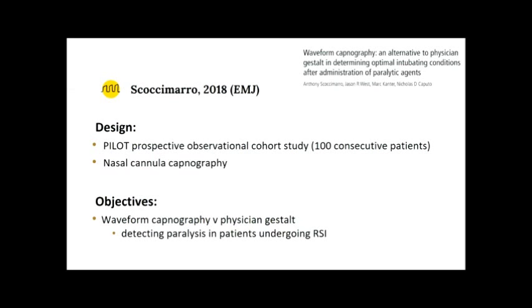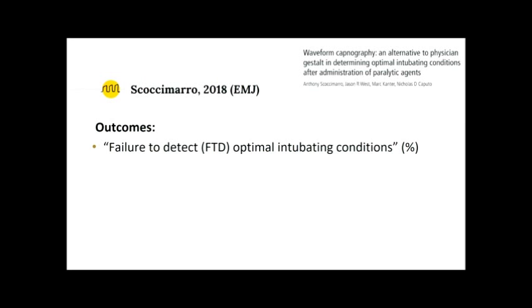And they wanted to compare waveform capnography versus physician gestalt in detecting paralysis for all their patients undergoing RSI. This doesn't include cardiac arrest patients, traumatic arrest patients, or anybody that required an awake intubation. Their outcome was failure to detect optimal intubating conditions, which is going to be referred to as FTD on the next slide.